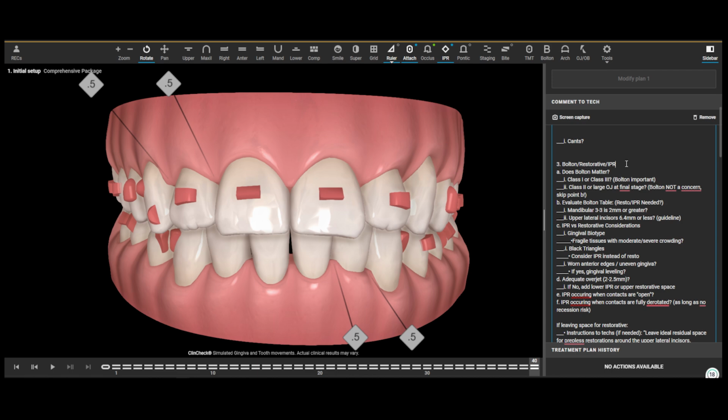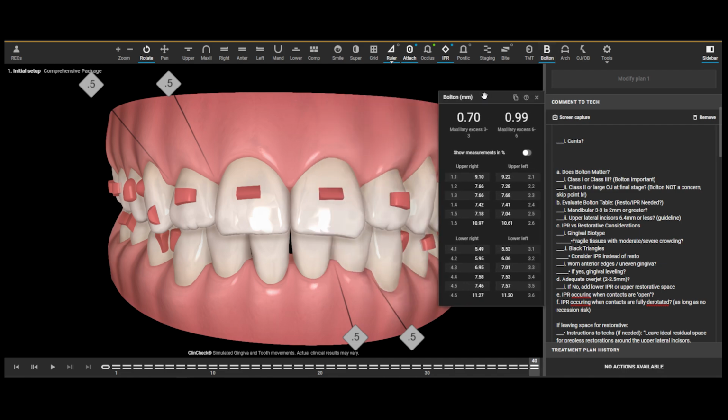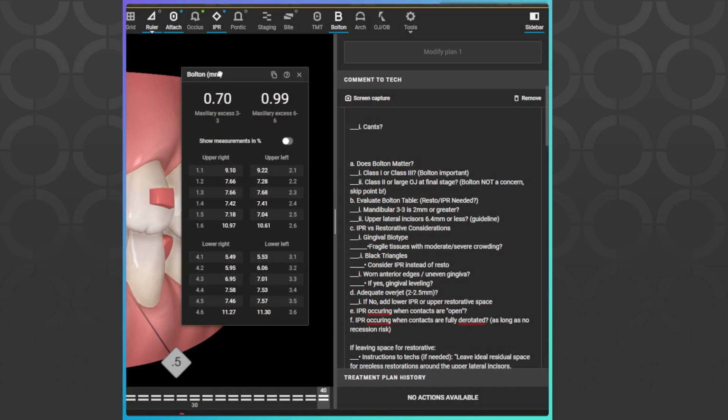Okay, what's next? Bolton, restorative, and IPR. So does Bolton matter? So first of all, what is Bolton? The Bolton is an analysis that you can see here by clicking on the Bolton tab, which is going to show us if there's an excess of tooth structure, either on the upper arch or the lower arch, comparing how they fit together.